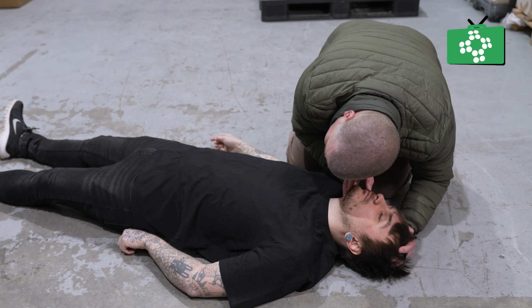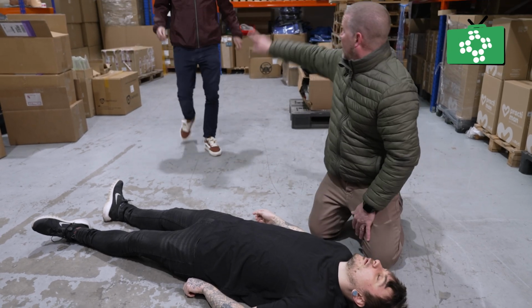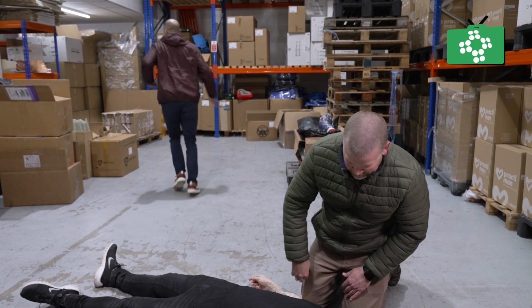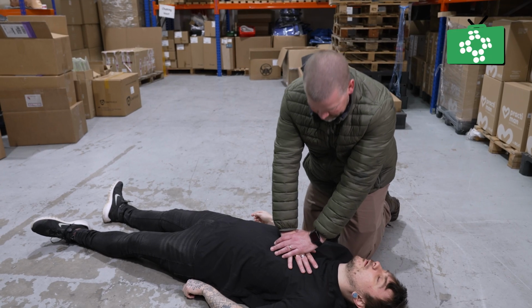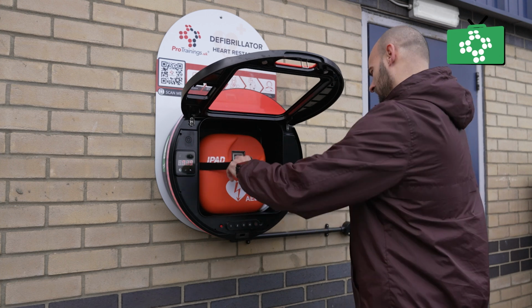At this point, someone should call the emergency services. So if someone is there to help, send them to activate the emergency services and fetch the AED unit as quickly as possible. If you're alone, then you need to call EMS, which you can do with your phone on speakerphone while delivering chest compressions. Continue CPR until the AED arrives.